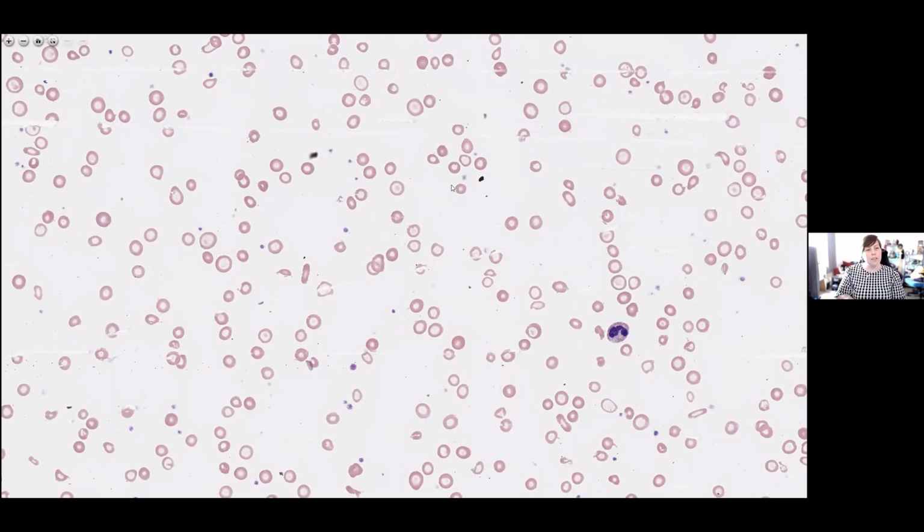And also I would check, not morphologically, whether the patient has an infection. Are there increased globulins? Is there any reason why there would be rouleau, I suppose? On the actual film itself, I find it would be easier to do with a physical smear rather than a virtual one. Virtual ones in that way can be a little bit limiting.